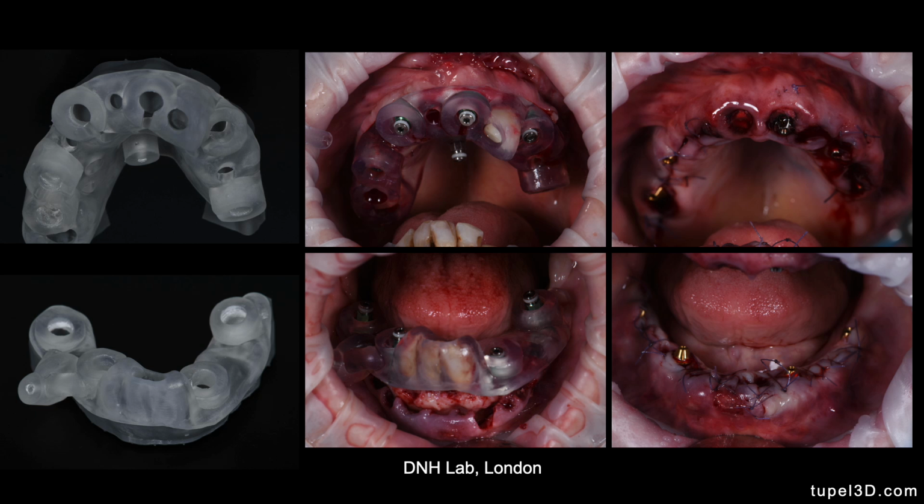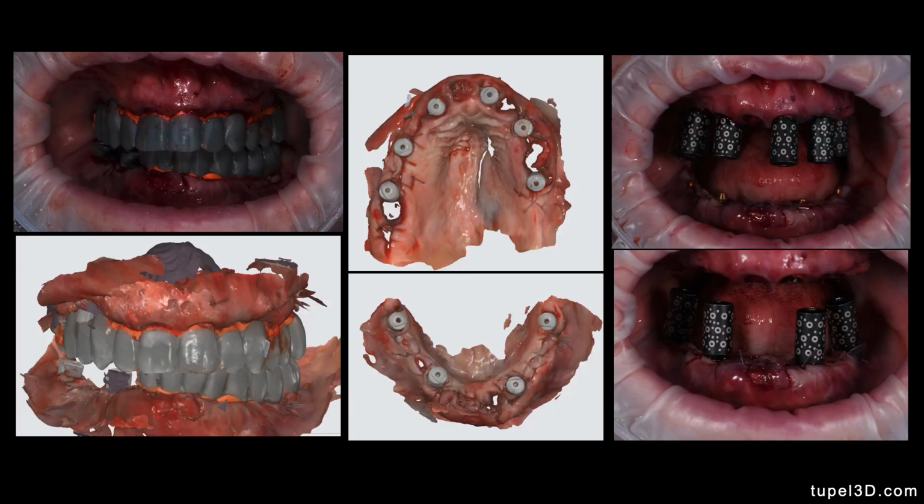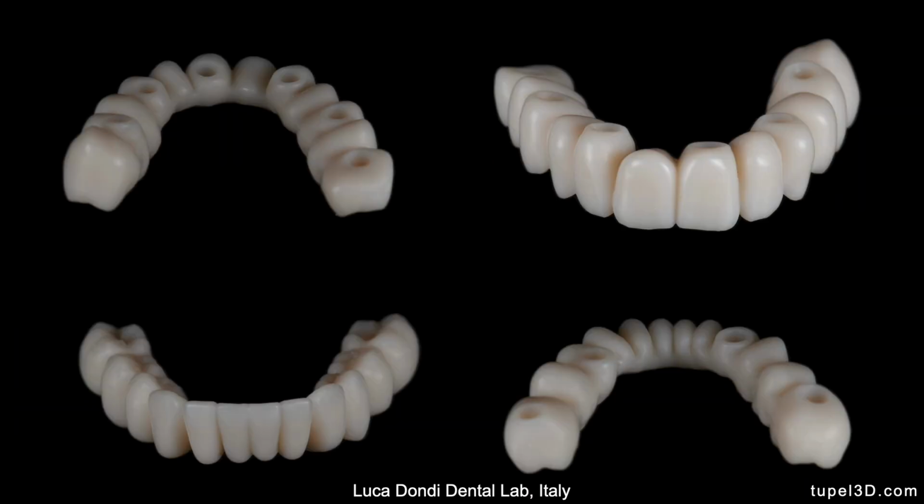and then I proceed placing, extracting the teeth, doing the bone grafting, the socket preservation procedure, the connective tissue graft, then place the implant, suture and fit the multi-unit abutments, and then with the digital pickup denture obtain the vertical dimension, then next scan the soft tissue with an intraoral scanner, then photogrammetry, and this is the type of interim prosthesis I'm able to design and then print on the same day of surgery, okay.